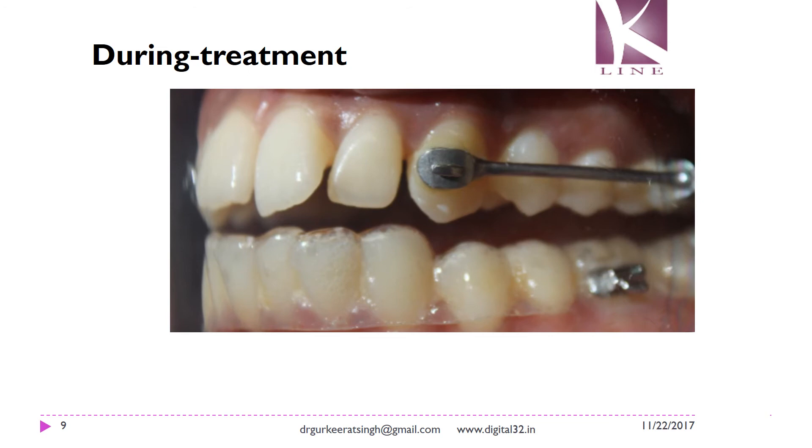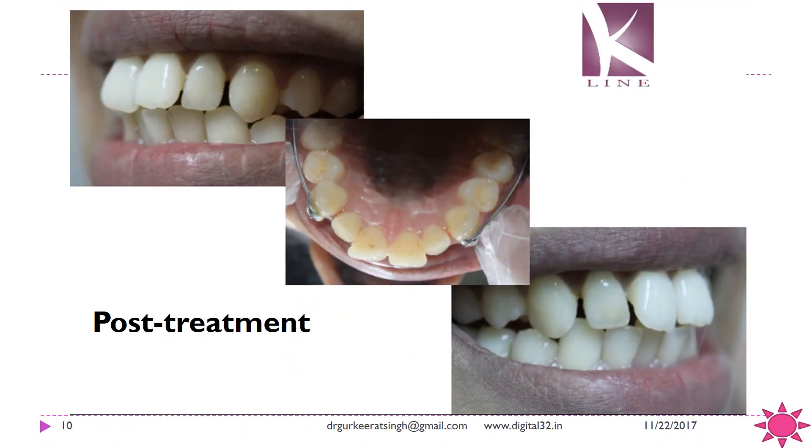You can use adequate elastic strength depending on whether you have the second molar — which would require more force — or no second molar, which makes it easier to distalize the maxillary molars. At the end of correction, you can make out the canine has come into a class 1 relationship on both sides, and you can very easily see that space has been generated mesial to the canine. One thing to be careful about is the tendency for the maxillary canine to slightly super-erupt because of the vertical component of forces generated by the class 2 elastic.